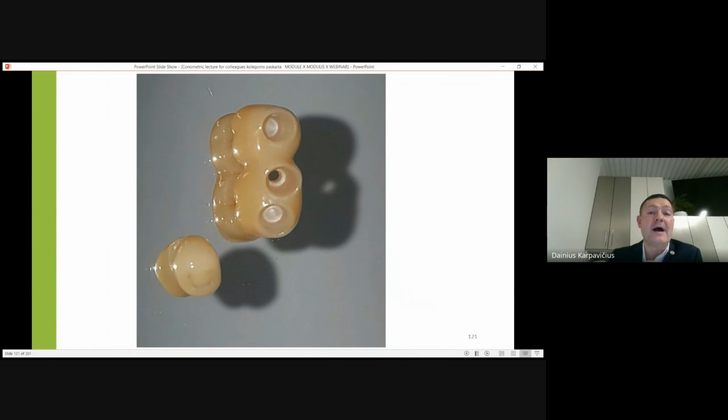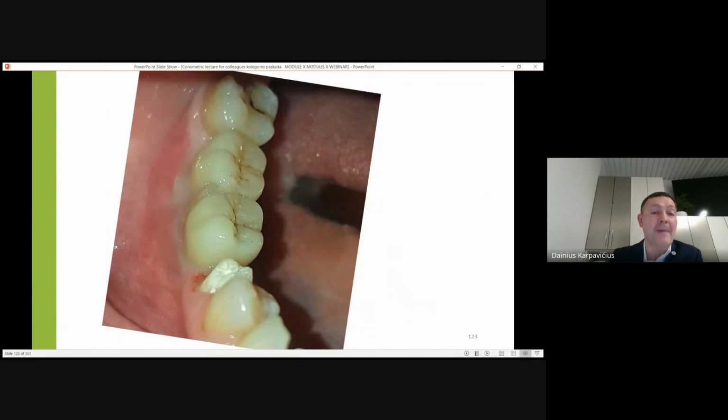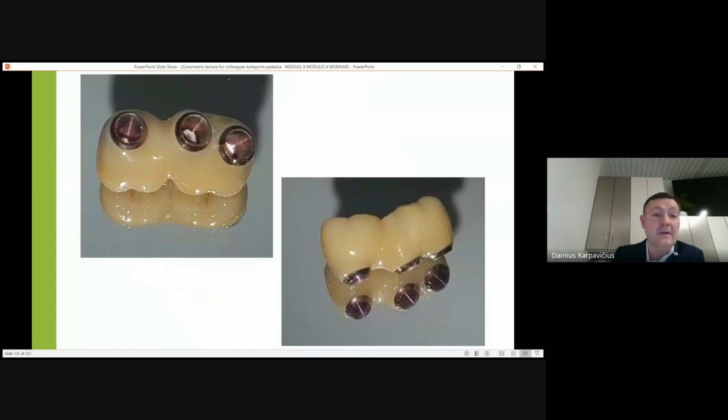Here we didn't use a crown remover, we left an open hole, and again, conometric, prepared for cementation in the mouth. We cemented the bridge. We opened this side for reaching the screws. Now you see the screwdriver, the screw that is inside. Everything is refixed from the conometric, refixed from the abutments. We clean everything, nice.